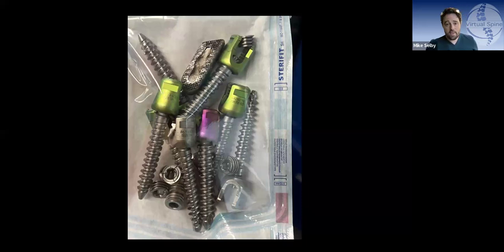And these were all the implants that came out. You can actually still see there at the top, that TLIF cage that came out, with the graft material still inside. So there's no bone in there. That is just graft material.